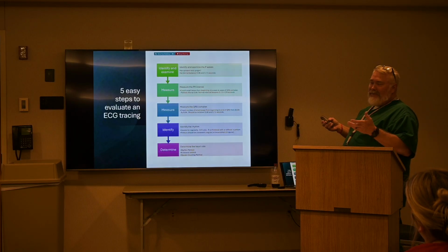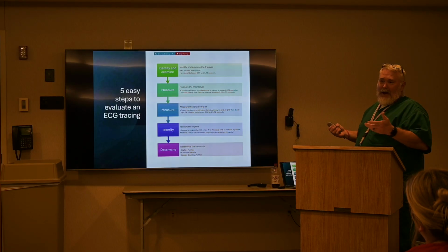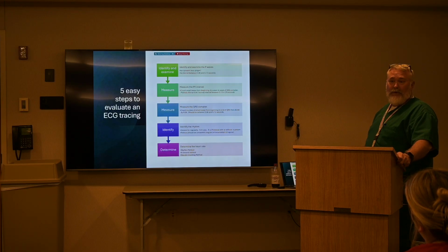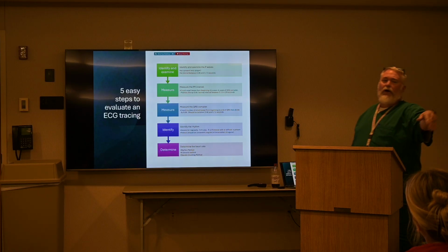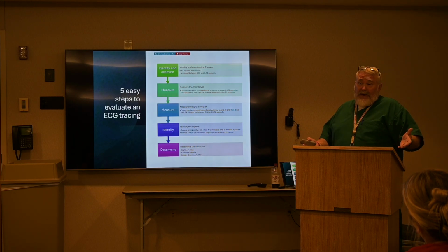So there's some semantics in that. I'll probably still measure it the same way I always have, from the beginning of the P to the Q wave. So which is it? Do I need to order different cards? No, I would do like the card says, because honestly, that's how most people measure.